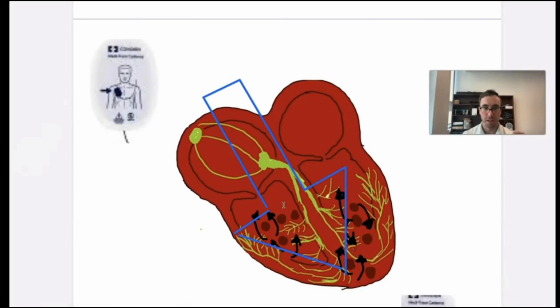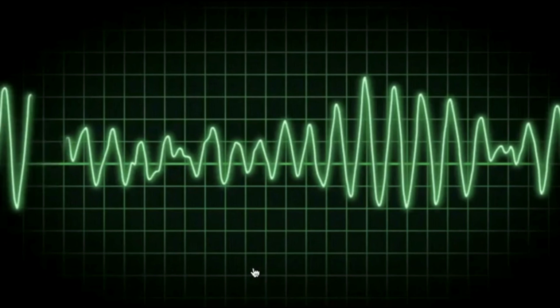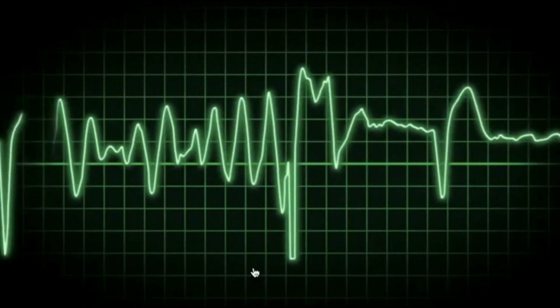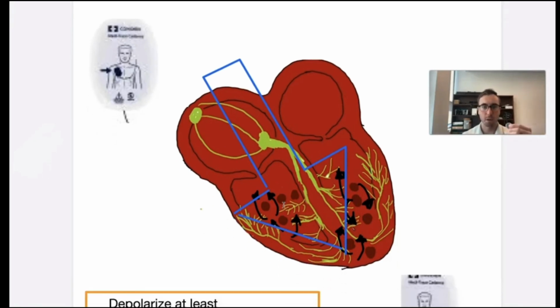So if we think very macroscopically, we defibrillate this patient. We know early defibrillation saves lives. That's why public access defibs became prevalent, and this is why there's a huge impetus to get a defib on the patient and hopefully defibrillate them into a normal rhythm that should sustain perfusion.